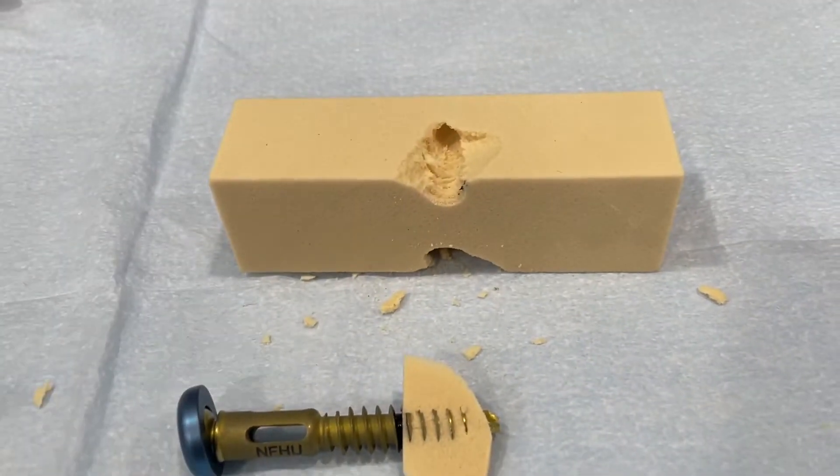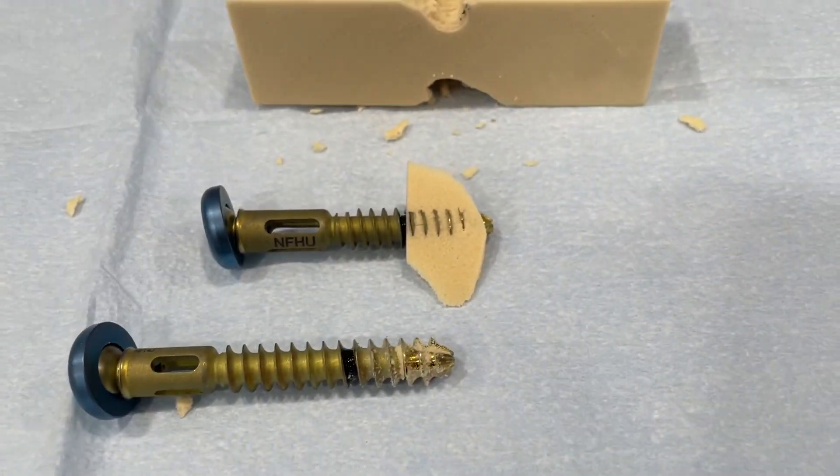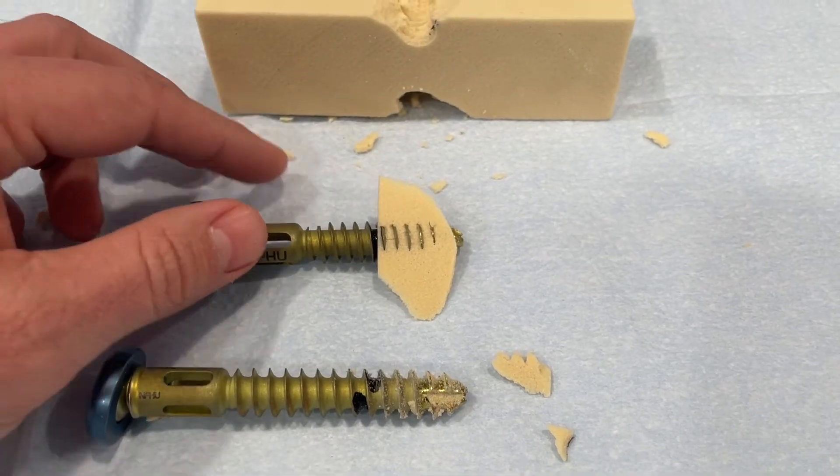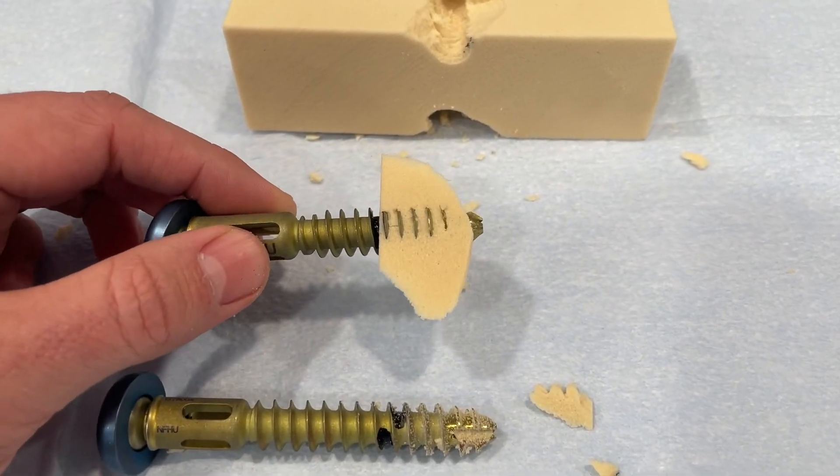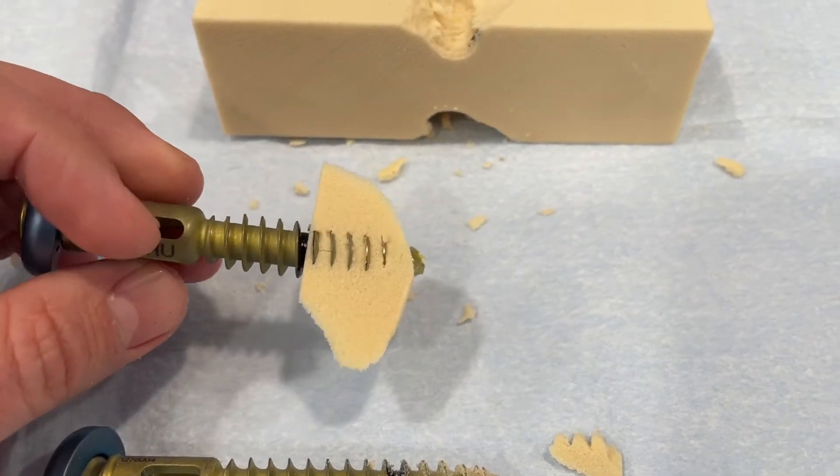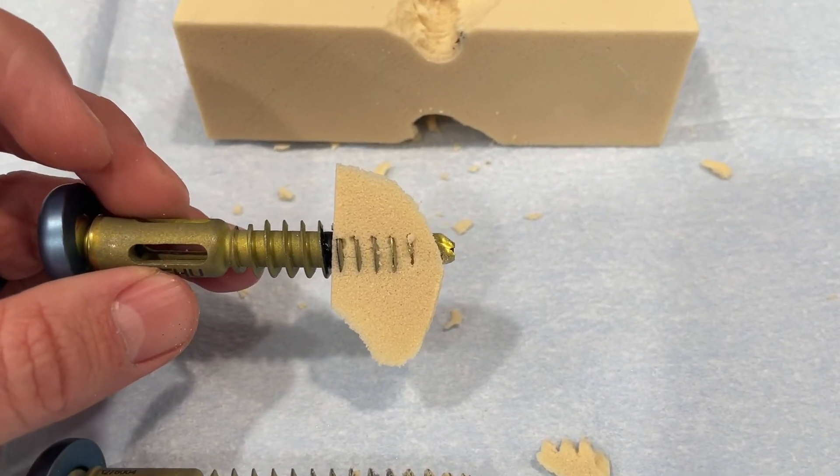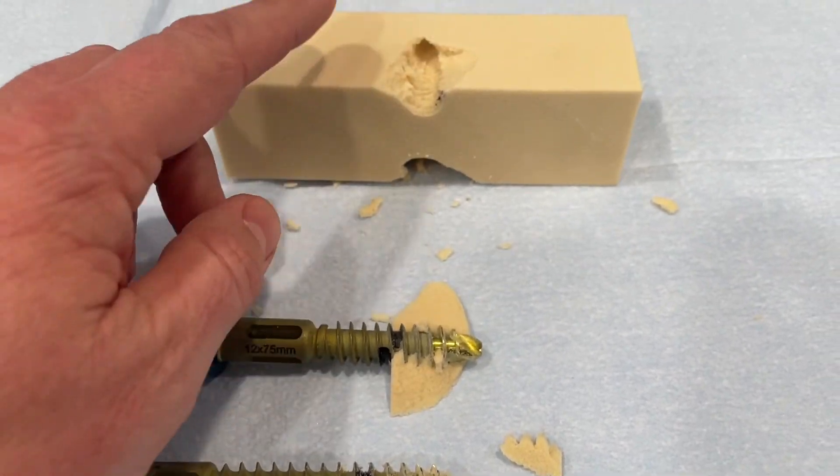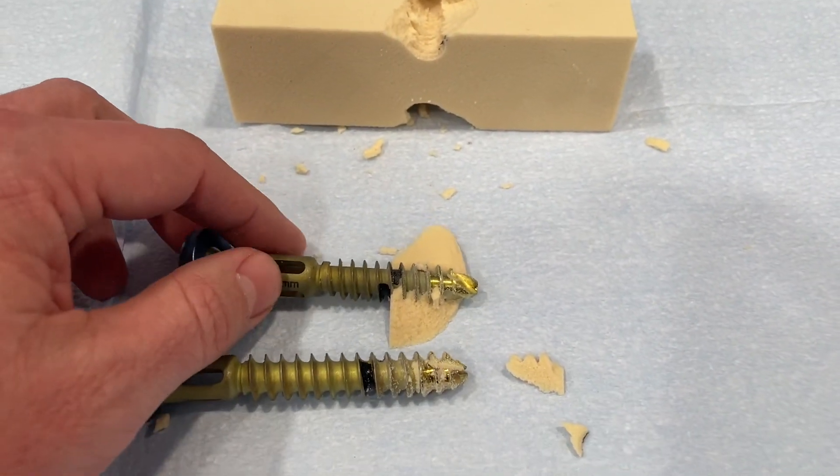Whereas before with a traditional style fastener, it pushed out and broke the bone out of the way, this one is mechanically integrated. That foam is still attached, holding on in that UniFi fastener. Pretty amazing to see the difference and noticeably more force to get it out of that block as well.